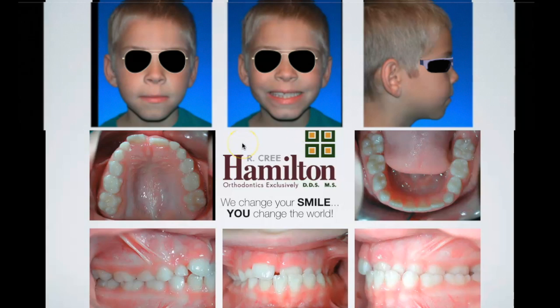Now, if you had a pano or a cone beam, you could actually measure the length from the condyle to the angle of the mandible, and you could see which one's longer from right side to left side. And that's, again, one more thing that will help you determine whether asymmetric growth has occurred or not. But at the end of the day, I want to make sure that this kid hopefully shifts back over and his midlines are closer to on by whatever we decide to do. Now, talking about justification and possible growth implications, that's one reason we justify the expander.